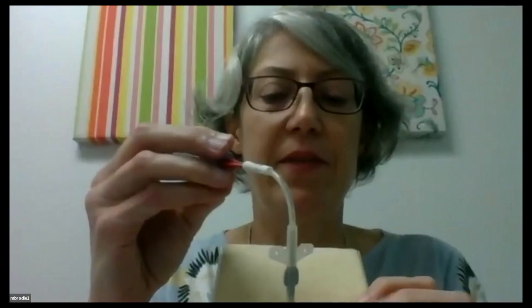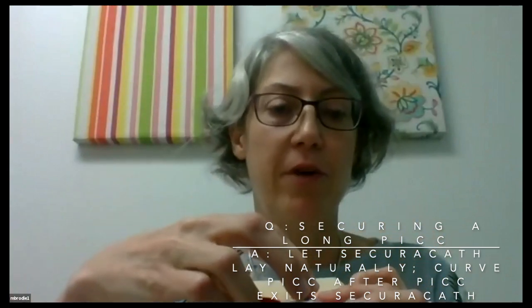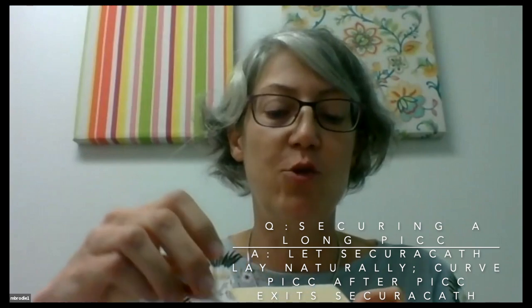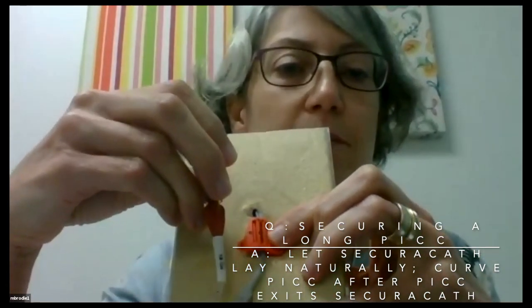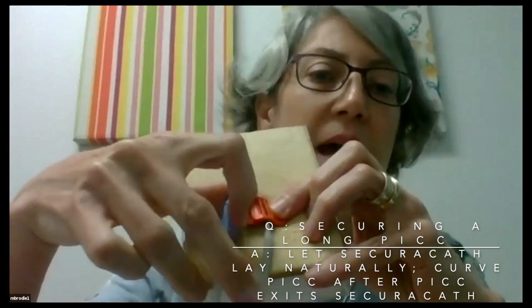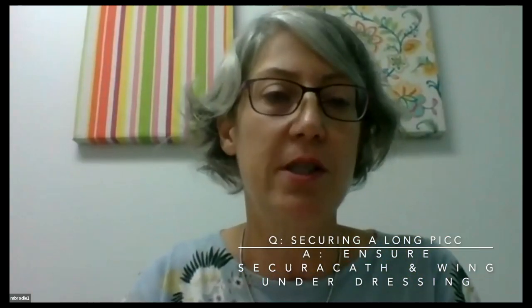You wouldn't want to bend it at the insertion site. So if it was, now this one doesn't have the longer external length, but if we sort of pretend, you would want to give a curve well after where the PICC line comes out of the SecurAcath, because you don't want it to kink. What you don't want is this, because then you're kinking the line. That's not really okay. You would have it more looped. Now this one's too short, but you would wait for the loop to come out after. And you might need to use a slightly larger dressing. Often securement dressings or any dressing will come in a slightly larger size, as long as you've got the insertion site and the wing under the dressing to cover the whole line.